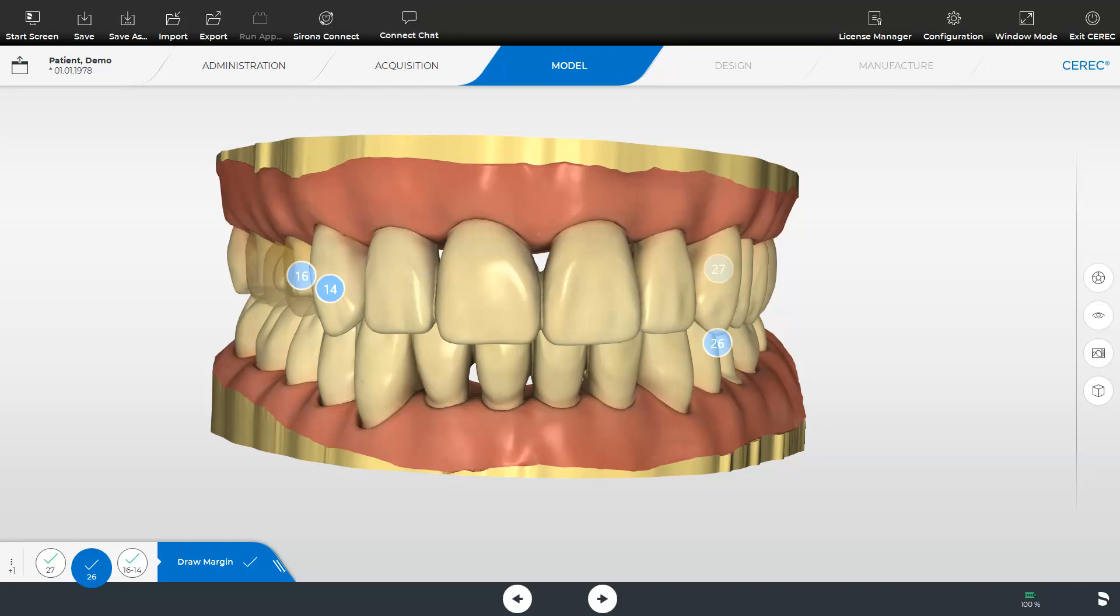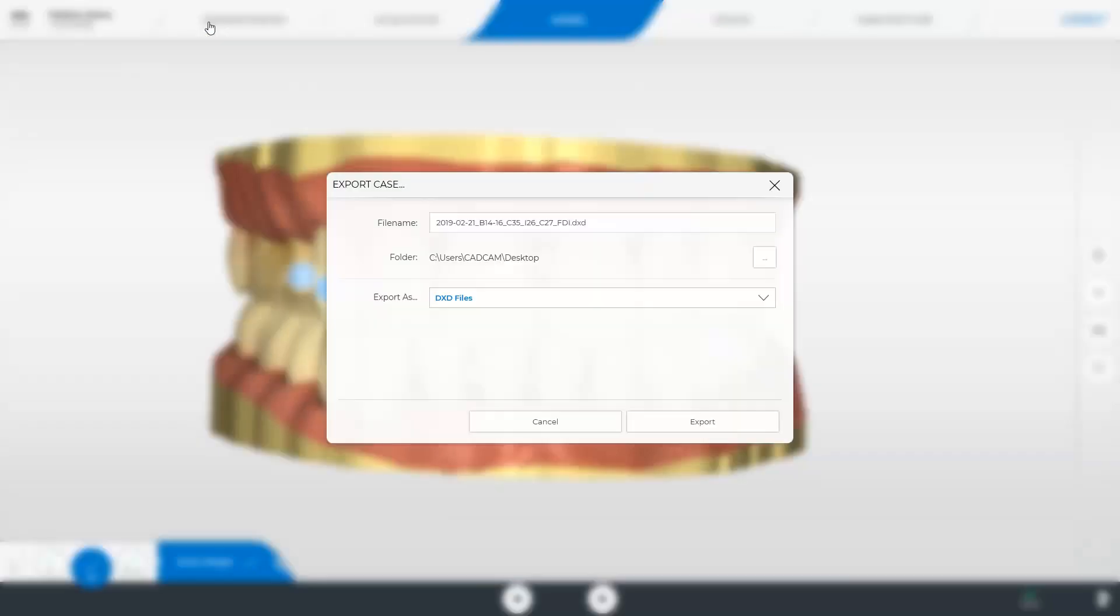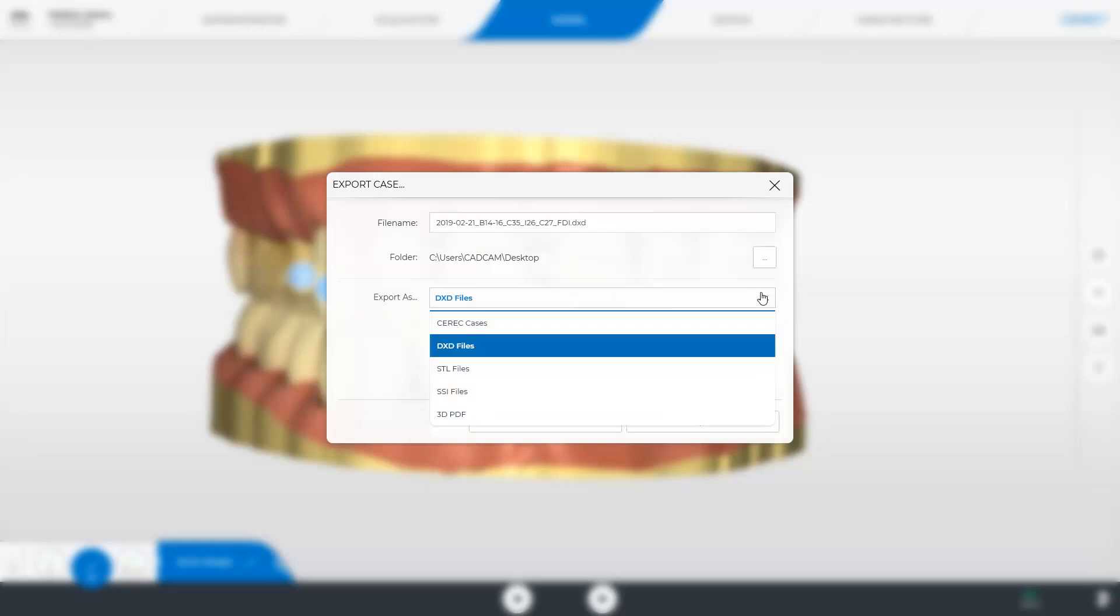To re-import into the CEREC software five the file must be in DXD format which is available in the in lab software as of version 18. To export the data to a storage medium we select the option export. Just like before in the acquisition phase the window opens again but in the model phase a larger selection of file formats is available. We tap the small down arrow so that all available export options will be displayed.